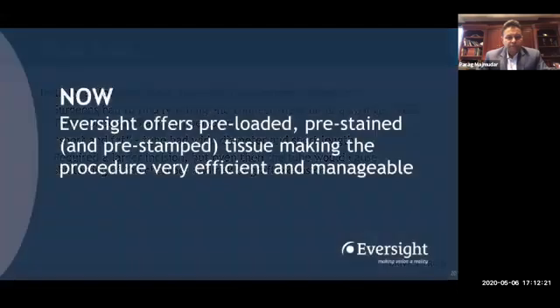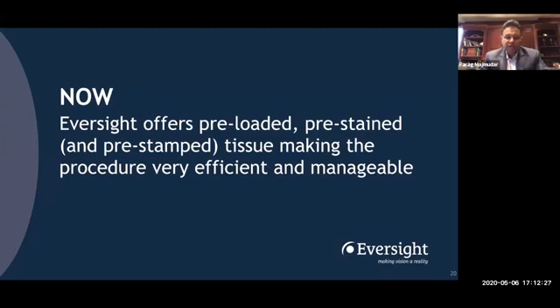And so when I did my training, I went to Rotterdam in 2013 to train under Gerrit Mellis, and they had been using a tube manufactured by a Dutch company called DORC, D-O-R-C, Dutch Ophthalmic Research Company. And that tube was fantastic. And I made it my mission, and thanks to Eversight for listening to my insanity, they worked with me every step of the way to get this tube available to us.